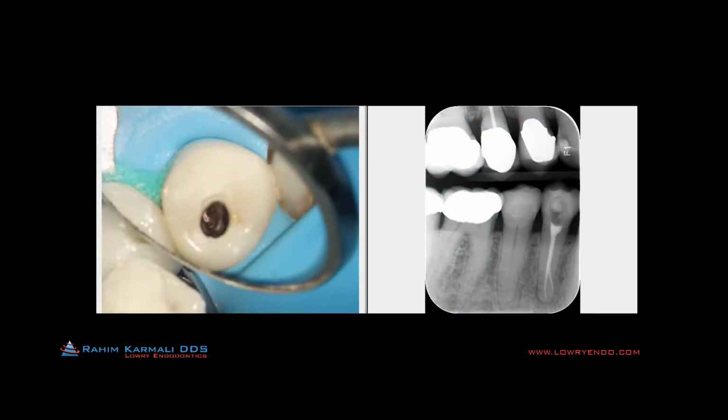So we removed the cotton pellet and we removed the root canal filling material, the gutta percha, from the 2 branches at the tip of the root. The dental operating microscope is another huge advantage in endodontics. It allows us to see things under high magnification and illumination, which without any other way you wouldn't be able to visualize. This is a little bit of the root canal filling material that's stuck in that untreated branch. If we're looking at it radiographically, we're looking down through the top of this tooth to about this level. And we've got great visibility to see where that untreated branch is.